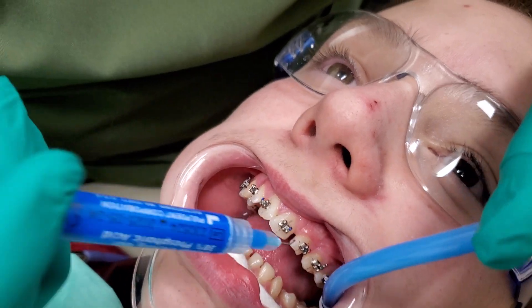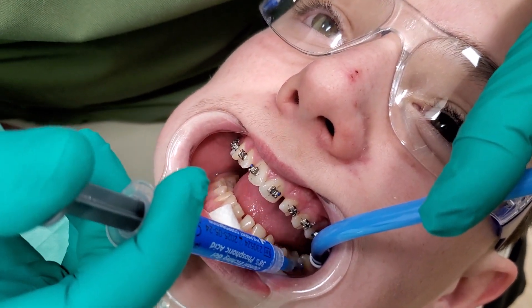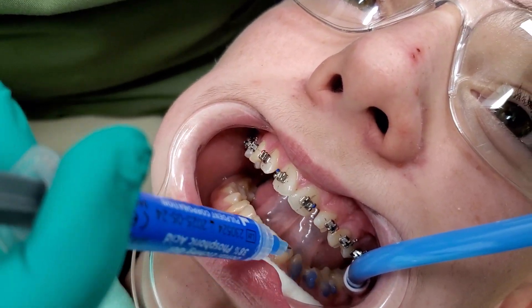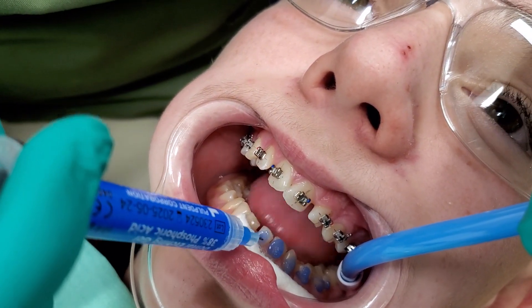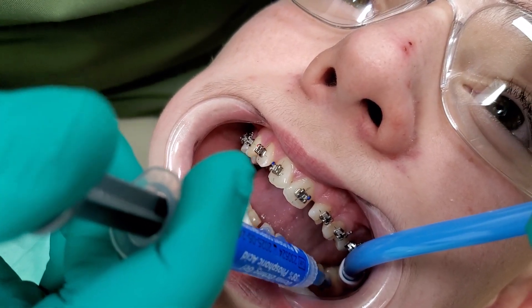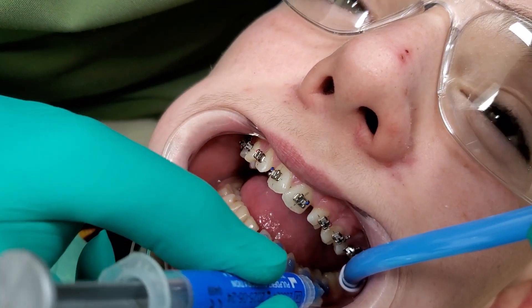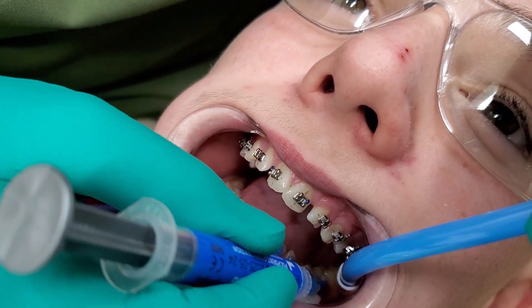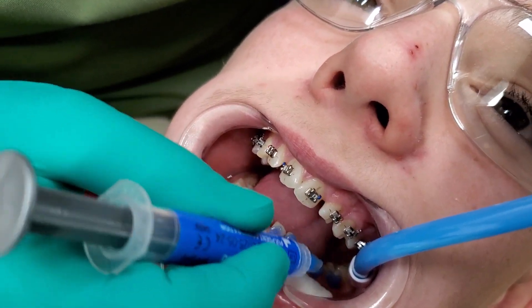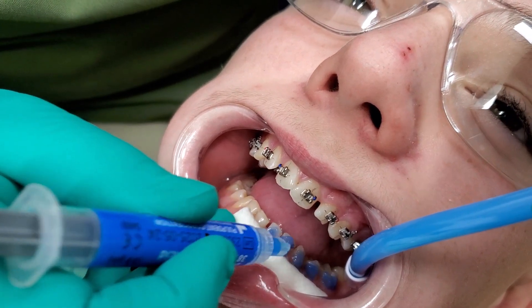I'm doing lower bracket two. I'm kind of counting off time in my head as I do this — 20 to 30 seconds. You want to agitate your etch on there. You just scrape it, push it against the tooth in a circular motion just to help work it into our little tubules.